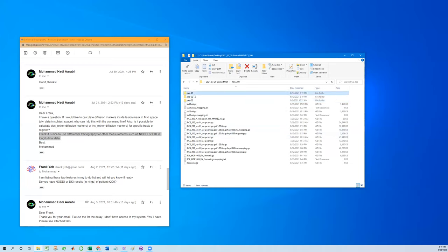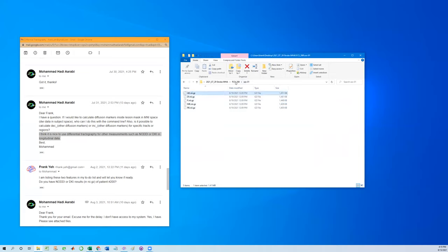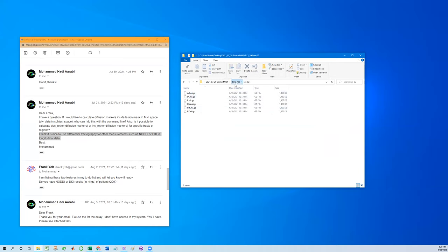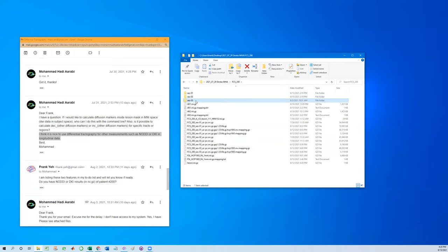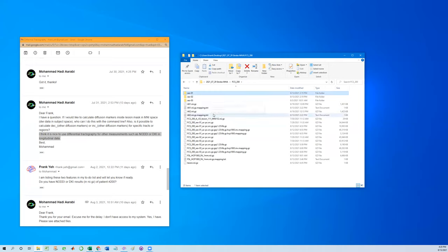He also sent me the diffusion kurtosis metrics in nifty format. As we can see here, this is the first scan, the second scan, and the third scan. So we will use the difference between first and second scan and use differential tractography to show tracks showing kurtosis differences.